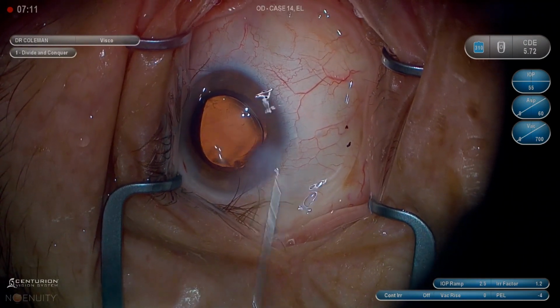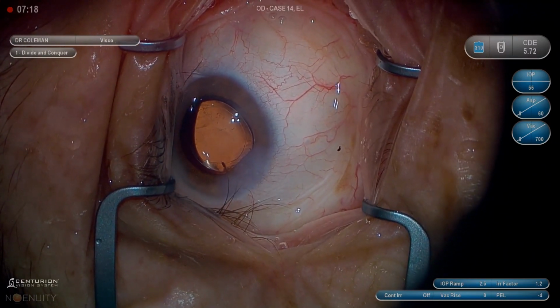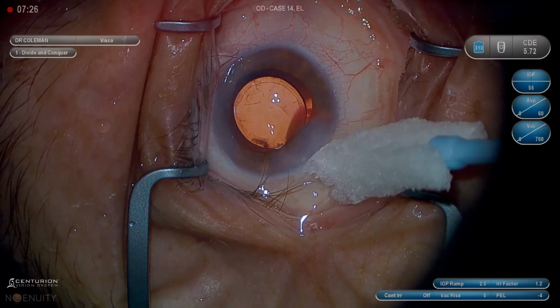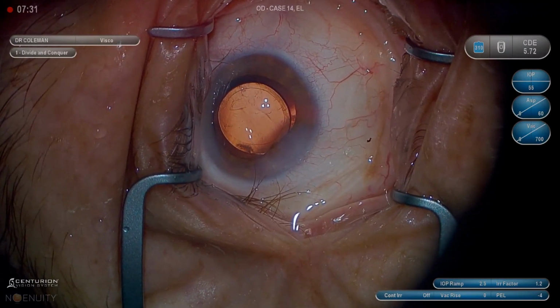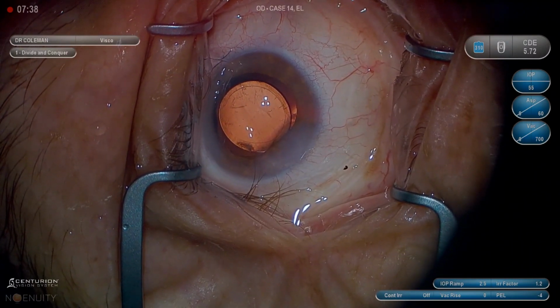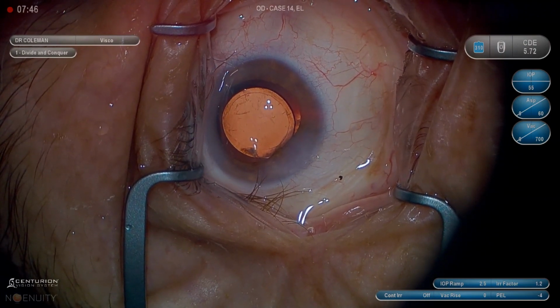Now here, we were able to seal the wound. We were able to get the iris back in the eye. But anytime you see iris prolapse, it never gets better, it just gets worse. So the more you fool with it, the worse the iris is going to be about prolapsing out of the eye. So the idea is to get it back in as few steps as possible. And once the wound is sealed, don't touch it again. If you need to put a stitch in, you can, but if the wound seals and the iris is not near the surgical wound, it's not necessary, because sometimes you'll go to put a stitch in a sealed wound, it will unseal, it'll be burped, and the iris prolapses again.